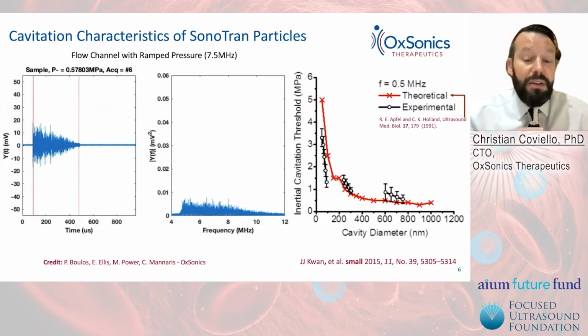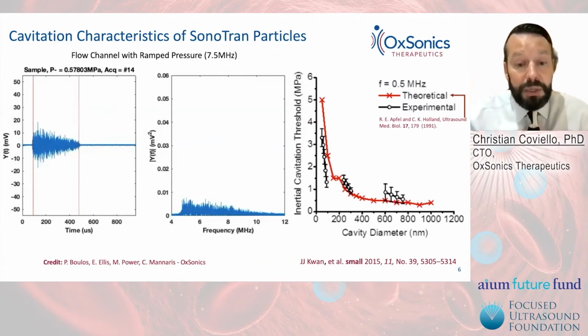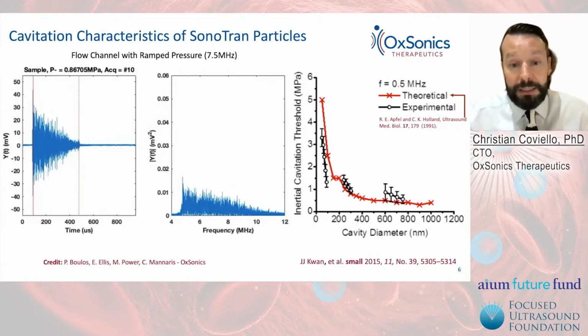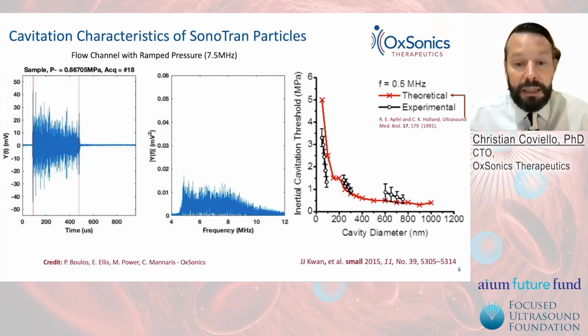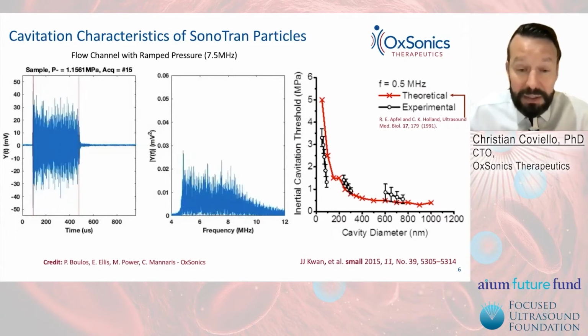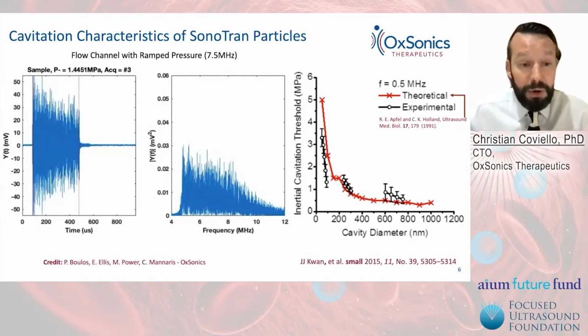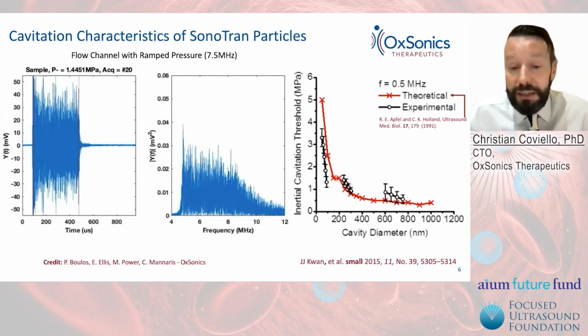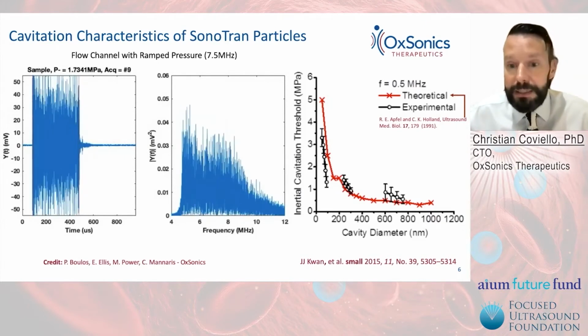But then when it actually rises above the noise level, what you see is domination by broadband emissions. Now, is that entirely inertial cavitation? Well, I'm sure, as Eleanor said earlier, it's quite a bit more complicated. But generally speaking, we would say broadband dominated emissions.